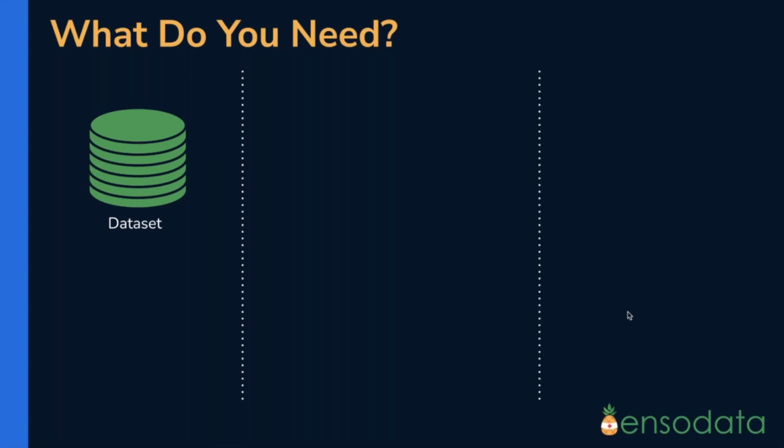label. Now, let's say in healthcare, the input data can be anything from medical images like MRI, X-rays, CTs, and so on. It can be tabular data like electronic medical record data. It can also be waveforms or physiological signals as well. And the labels can be anything from whether there is or isn't a cancerous growth in the image, whether a patient has a likelihood to develop some sort of disease based on their historical medical record, or, in sleep medicine, what sleep stage is represented by a certain window of EEG signals.